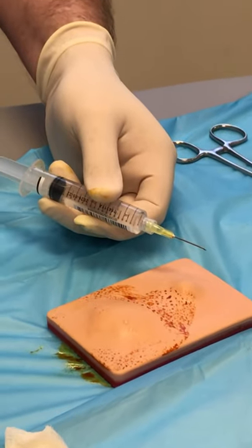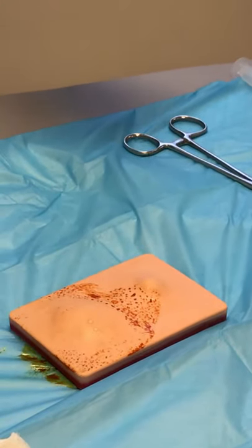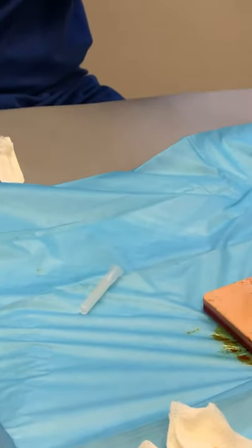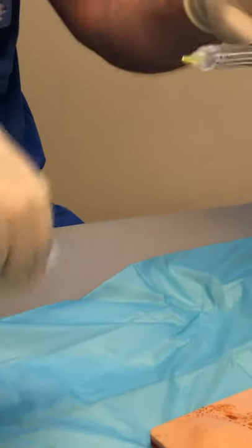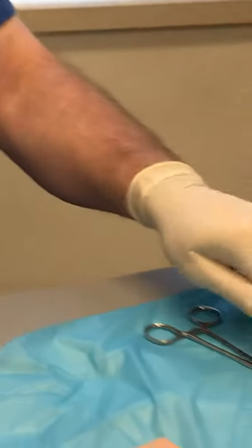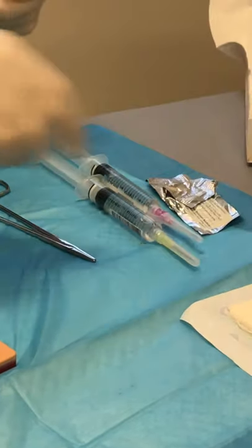One of the few times you'll ever want to recap a needle — I don't want to waste anesthetic in case I need to come back. If you ever have to recap a needle, always do a one-handed recap: put the cap on a surface and scoop the needle into it. If you try to do it two-handed you're going to stick yourself sooner or later. Scoop up the cap like that and make sure it's seated properly, so you have anesthetic available to use later.